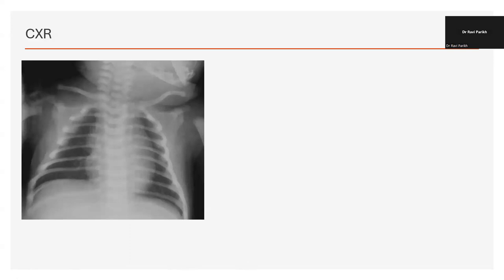Yeah. Like in the chest X-ray, it doesn't look like any obvious pneumothorax. Okay. So you are peer reviewing. And one of your colleagues comes back and says, well, you didn't pick up a pneumothorax. In the ultrasound? No. Yeah. That you were wrong. Yeah. Like it might be a small pneumothorax maybe, which was not picked up in the X-ray as well. Like it's not that obvious in the X-ray as well.